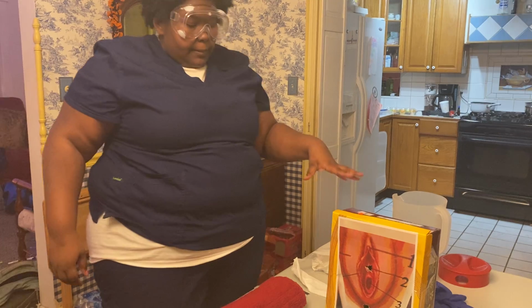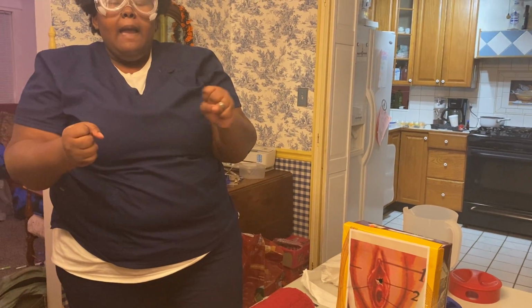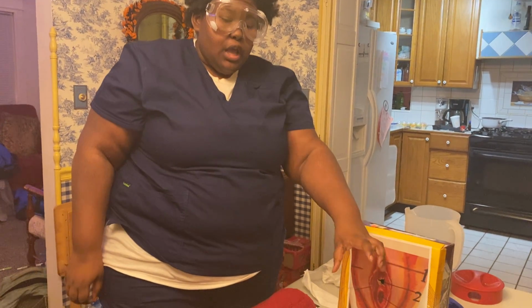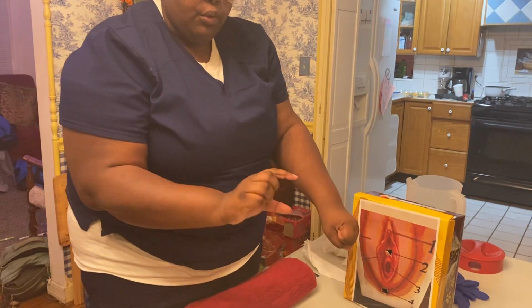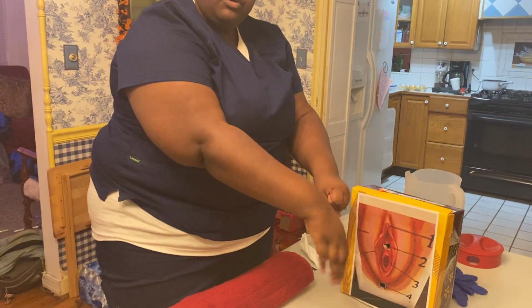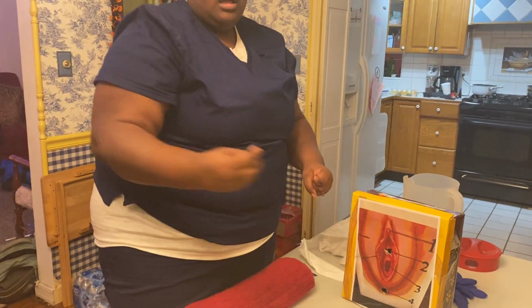Once I've done that, I will also do the male. For the male, I would take the penis in my non-dominant hand. With my dominant hand, I will go around the meatus, going outwards and down, and then I will throw away the gauze I used with warm soap and water.